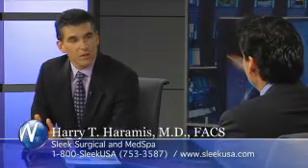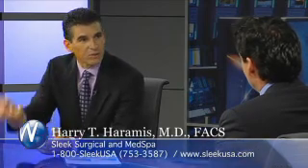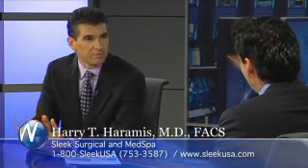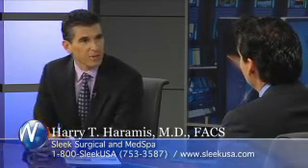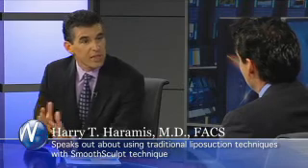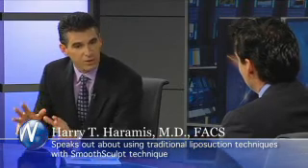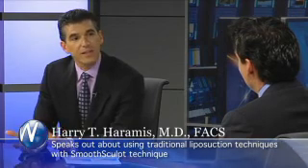Traditional lipo was almost like a vacuum cleaner, a little instrument going in and grabbing fat and pulling it out. This way, it takes that aspect out of the equation. We use the wetting technique, or the tumescent solution. We take the ultrasound, which uses high-frequency sound waves to dissolve the fat, melt it, liquefy it, make smaller particles. It also gives some skin tightening, and it's attacking the fat. It's aggressive, but it's delicate. It's not damaging nerves, blood vessels, or other tissue, making it much easier to pull the fat out.